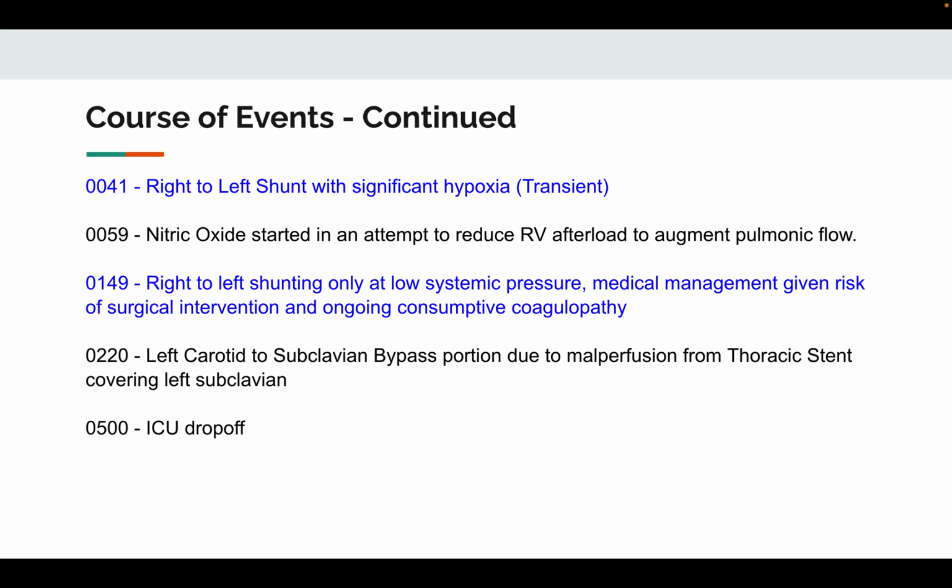After the total arch Thoraflex was done, they then deployed a hybrid Gore-Tex thoracic stent in order to cover up the primary defect in the descending aorta. I have a picture to show this. This is also unconventional. This was moderately successful, as usually fluoroscopy is required to appropriately place these. We were doing it under epi-aortic and TEE guidance. Dropped the patient off at 5 o'clock, so the case totaled about 13 hours in the OR.